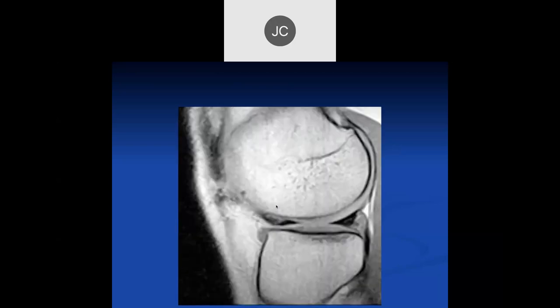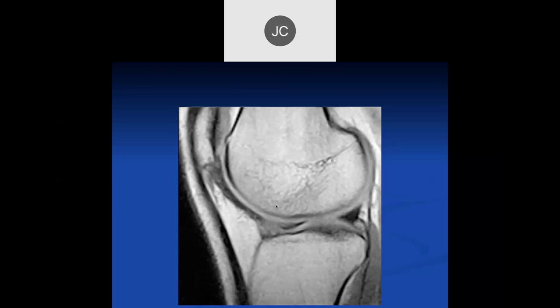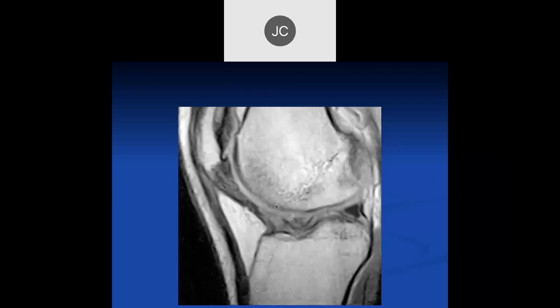Go back, that's what this cut looks like. Now, if we go in the other direction, it looks like this. And then if we go farther into the notch of the knee, it looks like this, and then like this. I see no root attachment at the anterior. So the thing is, what is this? Is that a plica? Well, you can think about it.